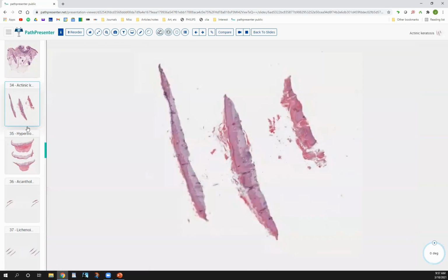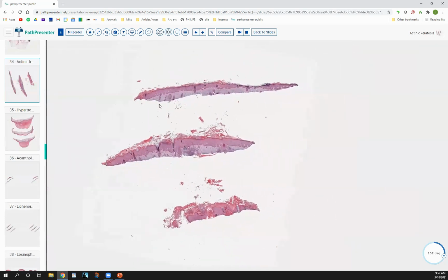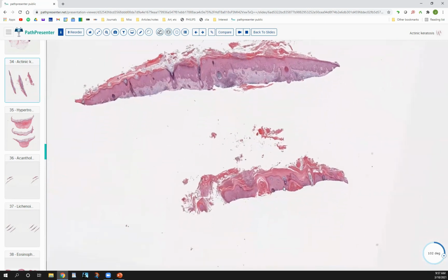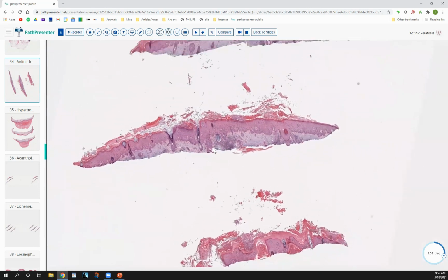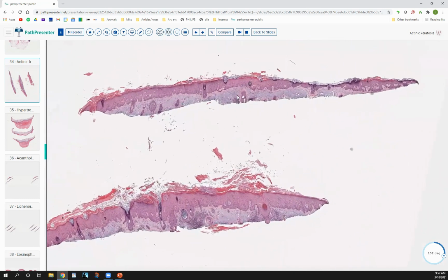Okay, so now we're moving on to another thing that's very common, like what we were talking about with the epidermoid and pilar cysts. This is an actinic keratosis, and I thought maybe it would be better to present the more interesting variants. Although I will go over the salient features of actinic keratosis, you'll see so many of them on your rotation that they'll become second nature after a while.